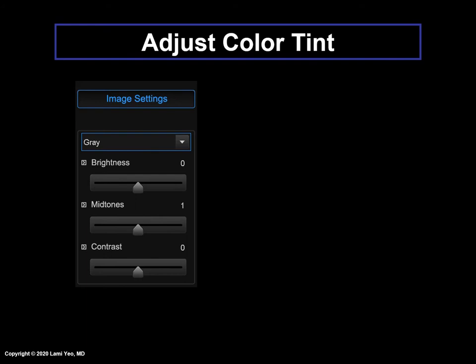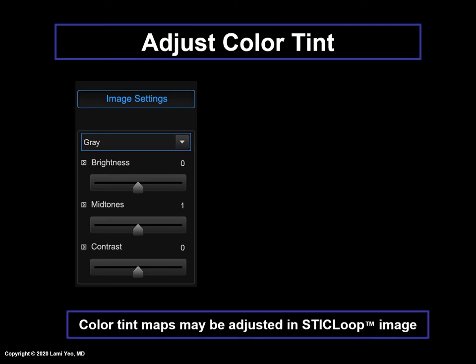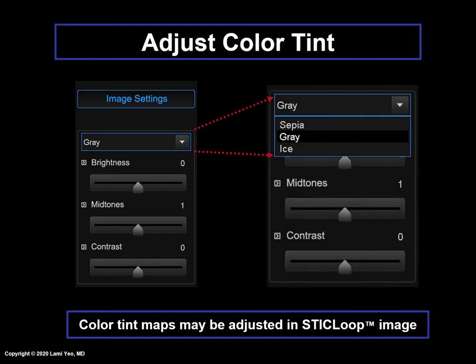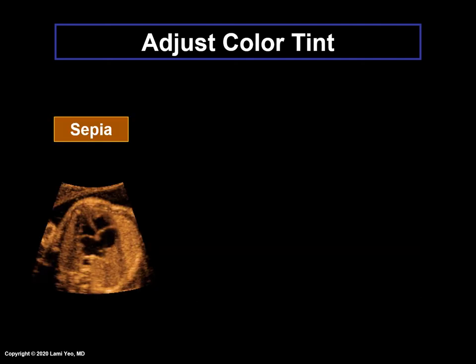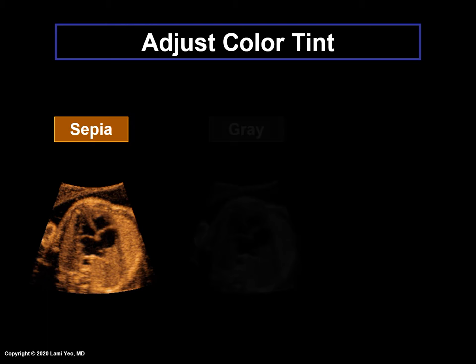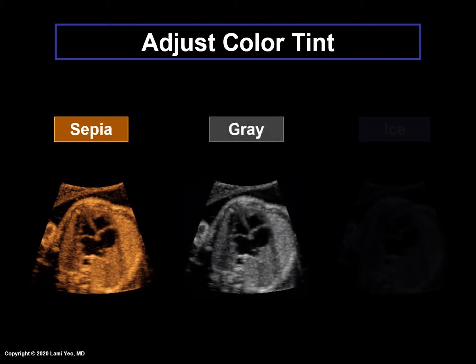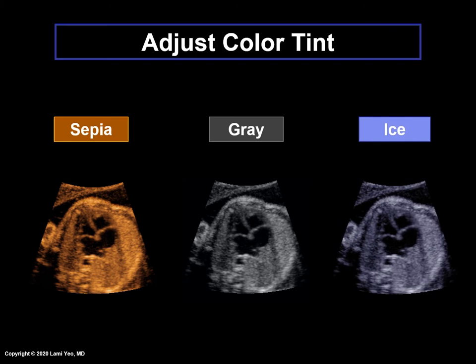Another adjustment that can be made to the STICLoop image is to the color tint. There are several color tint maps available in STICLoop and are chosen based on user preference: sepia, gray, and ice. Here are examples of the same four-chamber view in sepia, gray, and ice color tint.